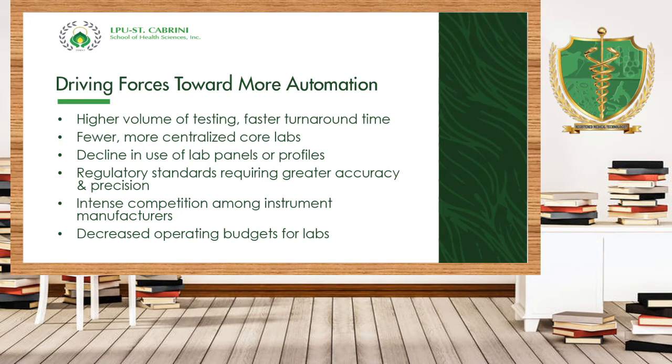Or considering the fact that we are experiencing the pandemic, if we are going to amplify, if we are going to extract, if we are going to denature protein in a very obsolete way or in a conventional way, baka yung backlog natin in the testing still, no? Ganun pa din kataas. Now that's one reason why we have to do the automation to lessen the turnaround time.